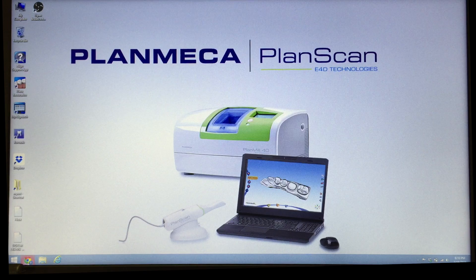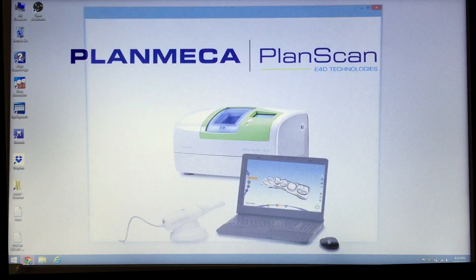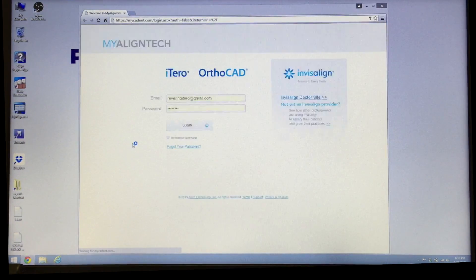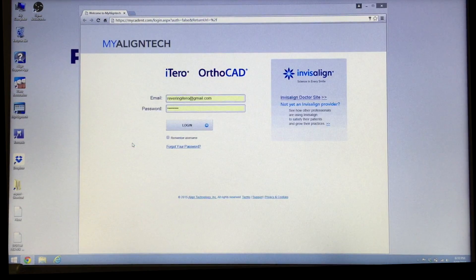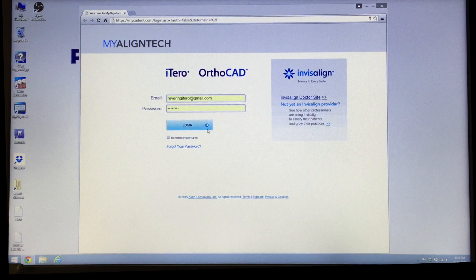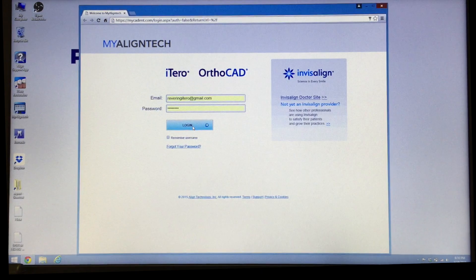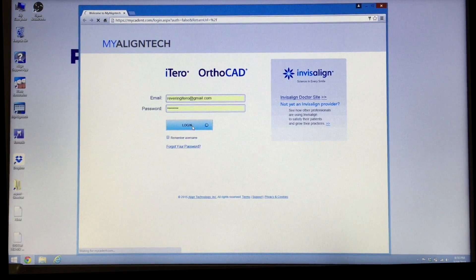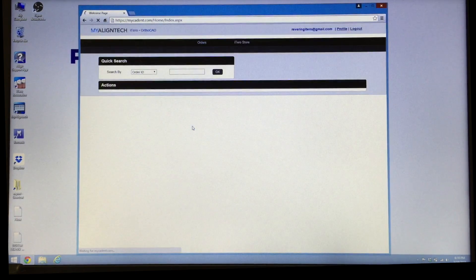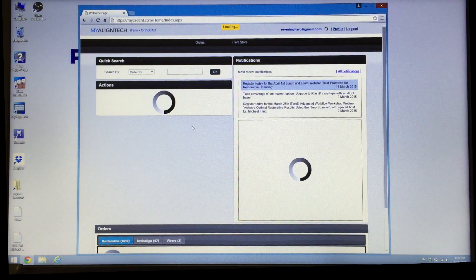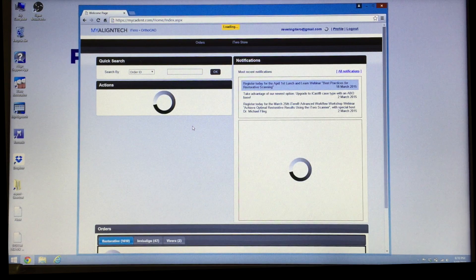In this video we're going to be talking about how we take our image that we've scanned in the iTero unit and then how we export that out to this desktop so we can import it into the Romexis design software.